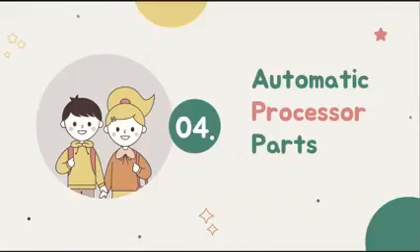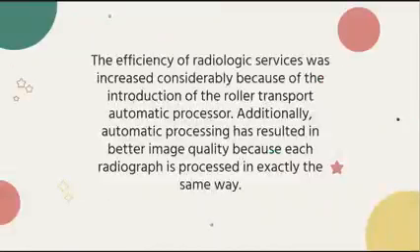So to start, the efficiency of radiologic services was increased considerably because of the introduction of the roller transport automatic processor by the Eastman Kodak Company. Additionally, automatic processing has resulted in better image quality because each radiograph is processed in exactly the same way.